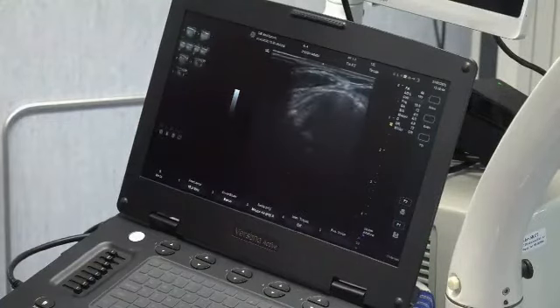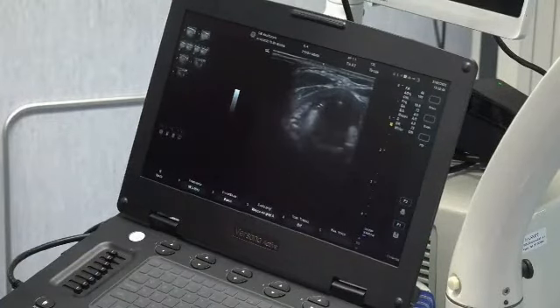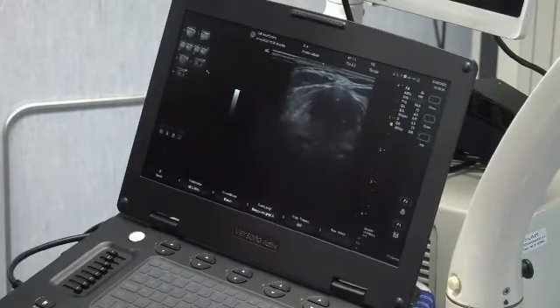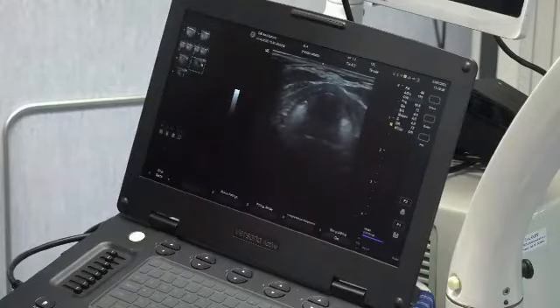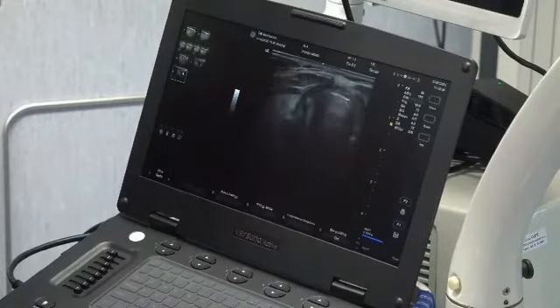Transcutaneous laryngeal ultrasound is done prior to the procedure. The movement of the true and false vocal cords is evaluated during spontaneous breathing and phonation. During phonation, the vocal cords appear as hyperechoic vibration in midline.